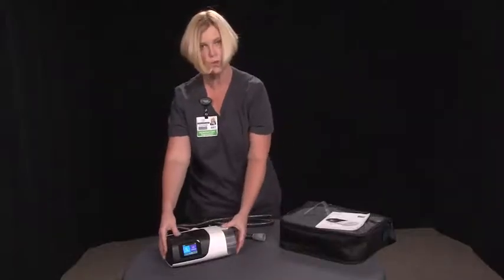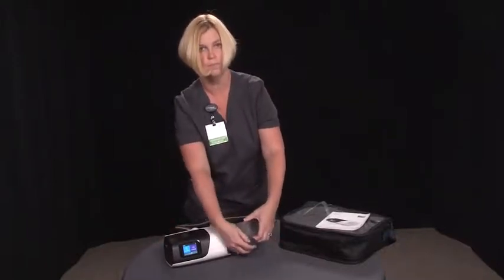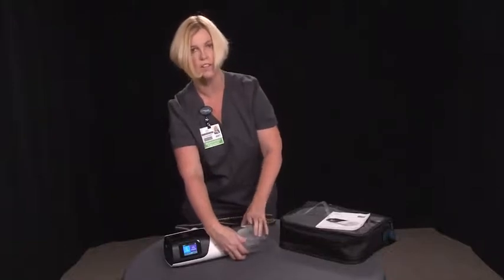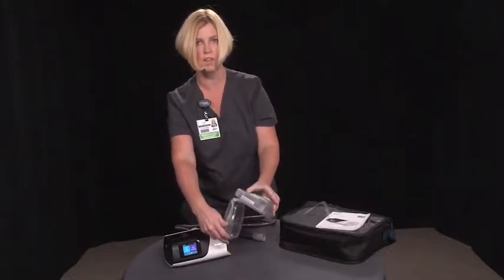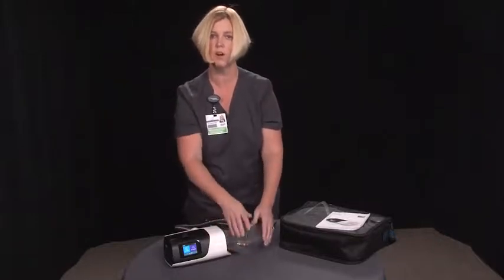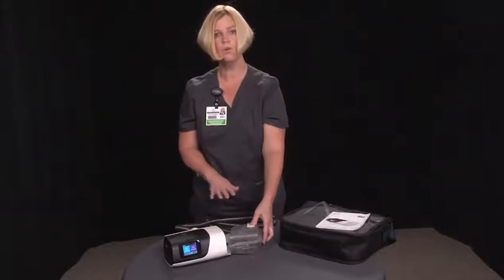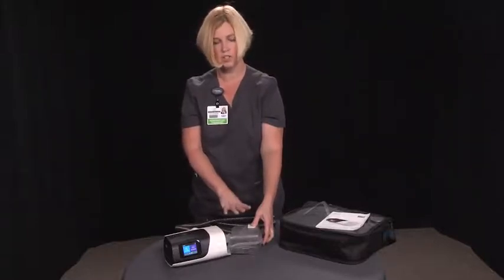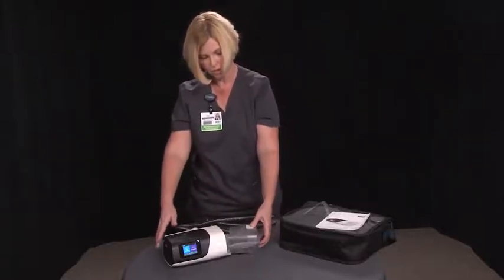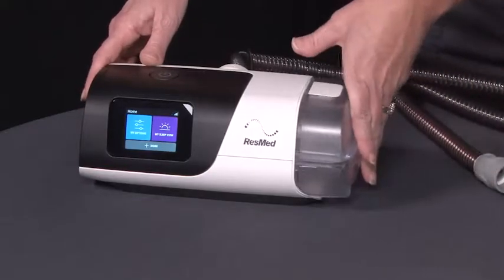You'll want to remove your water chamber each morning, open it up, and dump out any distilled water that would be left over in the morning. You always want to use fresh distilled water each night so that there is no chance for mold or mildew growth in your water chamber. When you're done, you can either leave the water chamber open or slide it back in your machine.